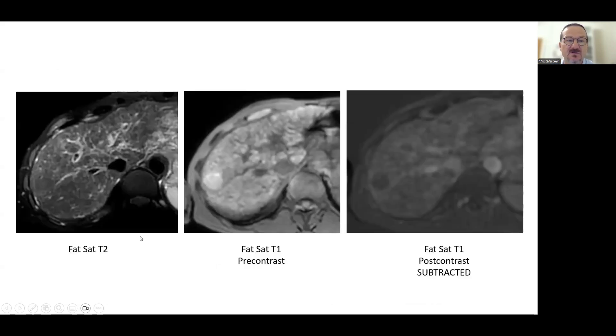This is another dysplastic nodule, iso-to-hypo-intense on T2, hyper-intense on T1, and no contrast enhancement.